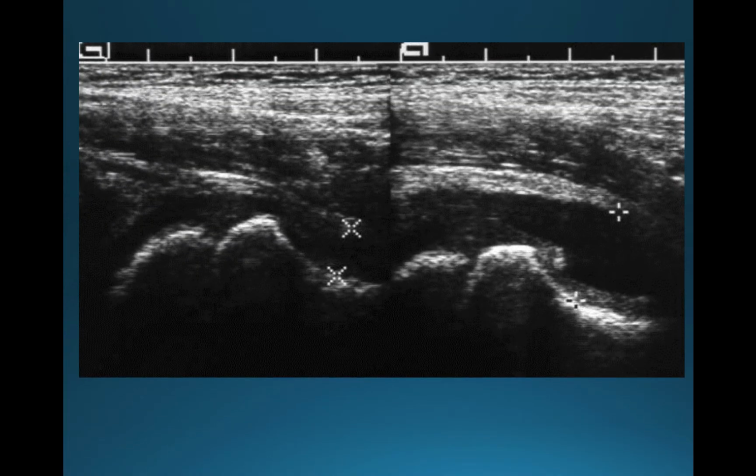So here's our ultrasound. Acetabulum, femur, joint, acetabulum, femur, femoral neck, and look at this joint effusion. So that's what we're looking for right here. And you can compare these side by side. Normal, abnormal. So the nice thing about the hip joint, or really any joint, is you usually have two of them for the most part, and you can compare side to side.